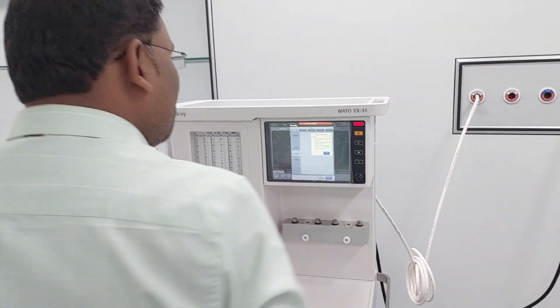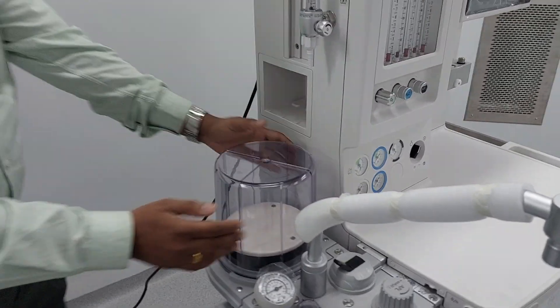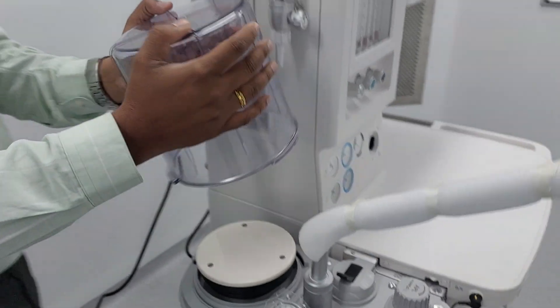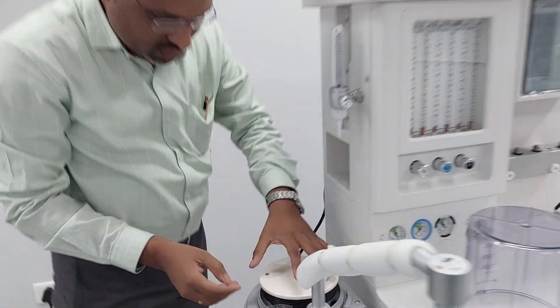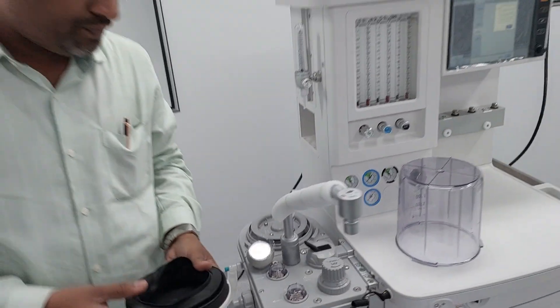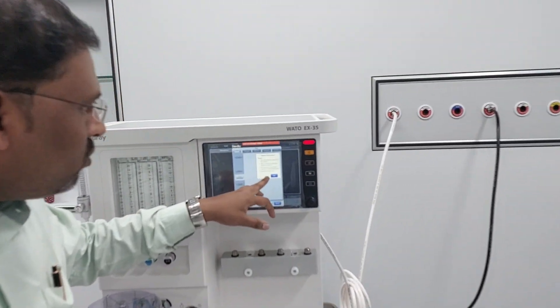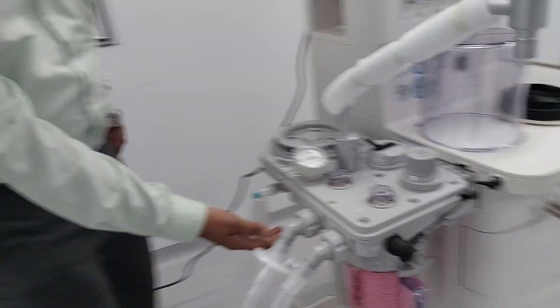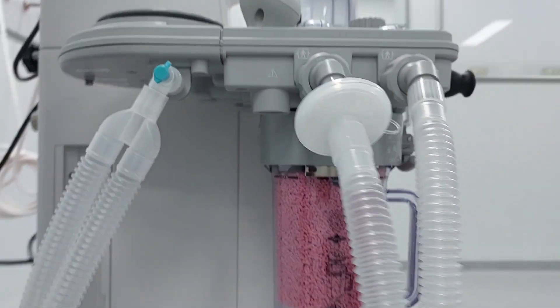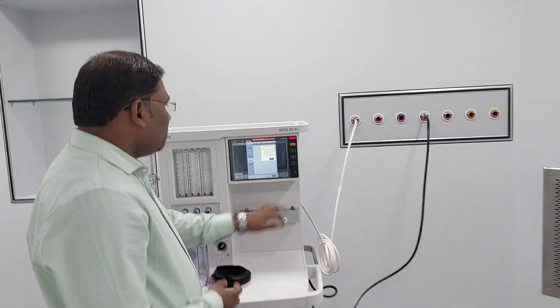After that, remove the bellows from the bellow mount and reinstall the bellow cover. To remove the bellows, rotate it in this direction, then keep it aside. At the bottom, try to remove the bellow. After that, remove the water track — at this position you can see the water track; just rotate and pull it out. Put it aside properly, then press Next.